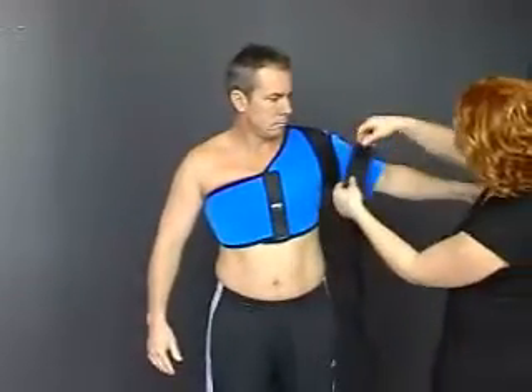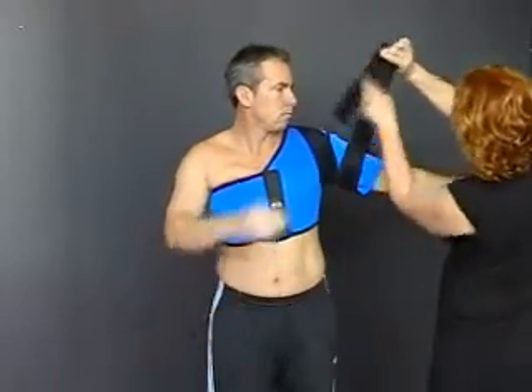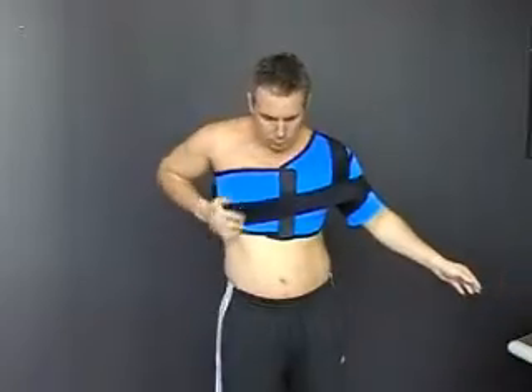Using the long strap, attach the strap to the top of the arm. Wrap the strap around the arm and, with the arm by the side, firmly fix across the body.